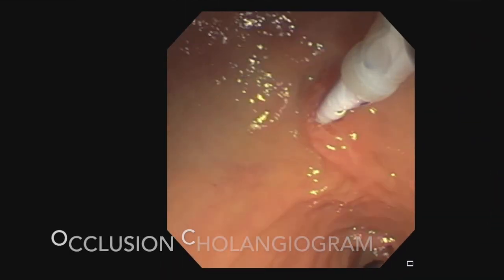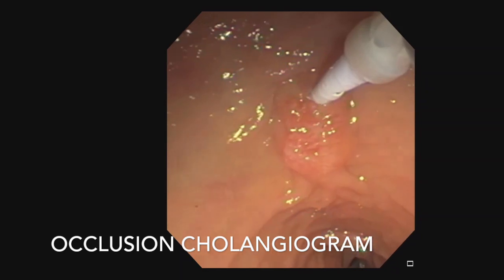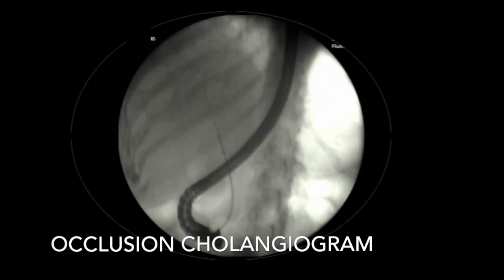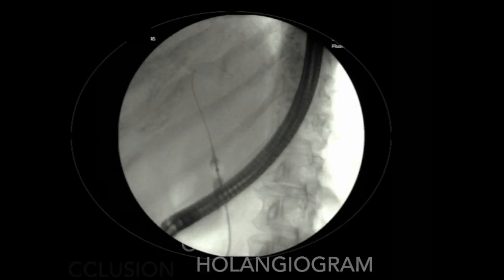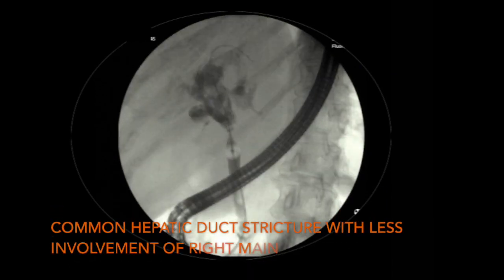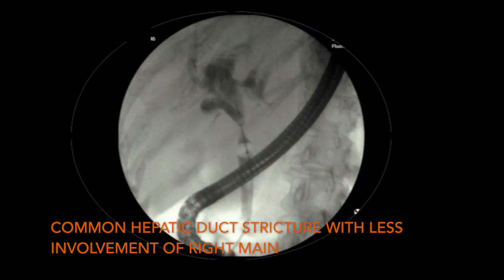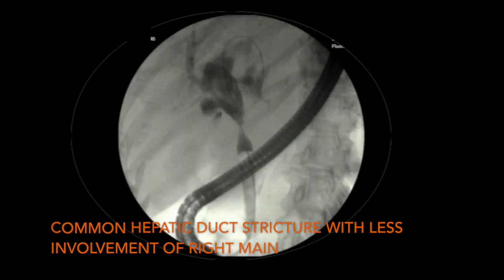Here we've removed previously placed stents and are cannulating the bile duct with an occlusion catheter. We now perform an occlusion cholangiogram, and you can see where the stricture due to cholangiocarcinoma involves the common hepatic duct and some of the right main hepatic duct.